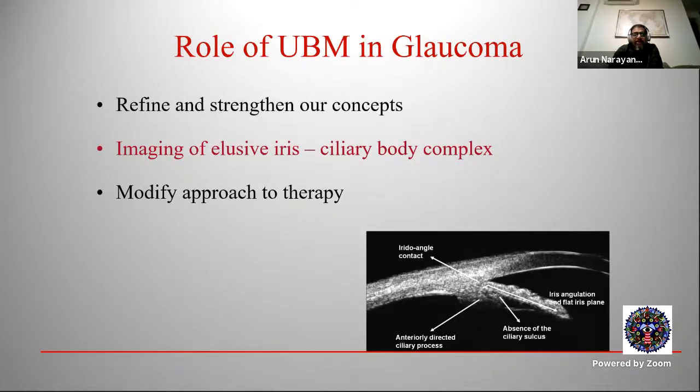Now, UBM made a lot of changes to what we knew about glaucoma. It refined and strengthened our concepts, especially the imaging of the iris ciliary body complex, which gave us new insights into different pathologies and also helped modify the approach to therapy.